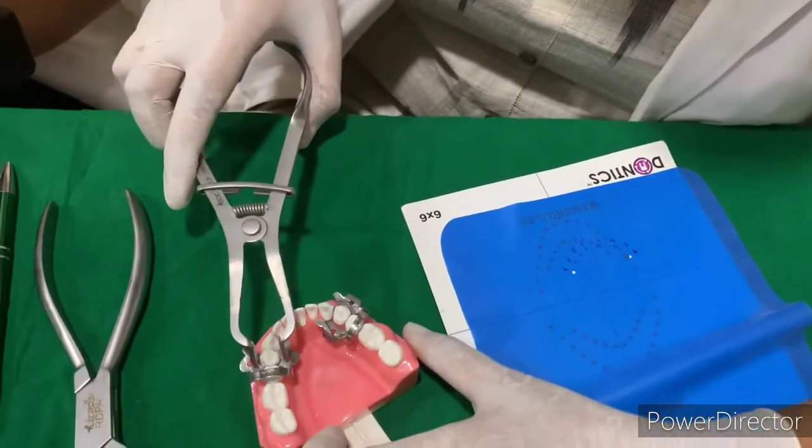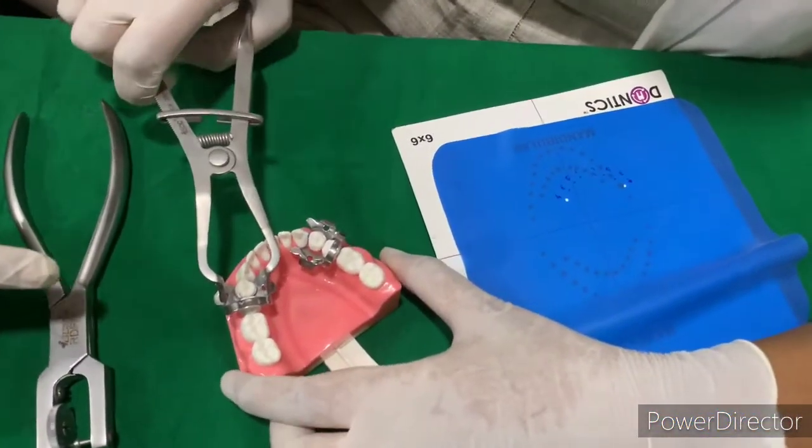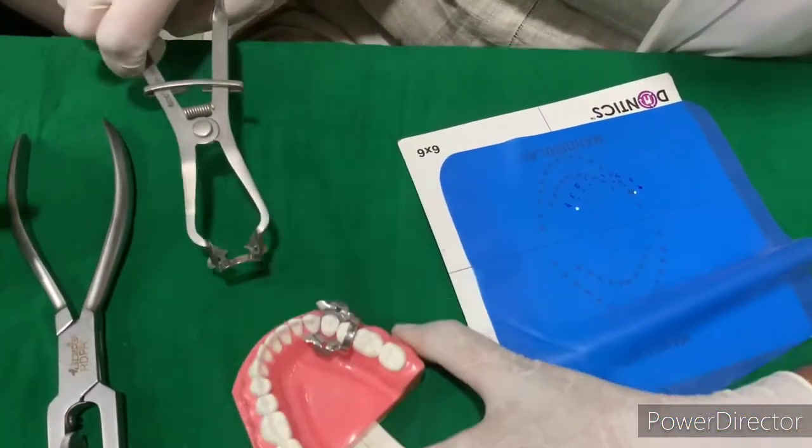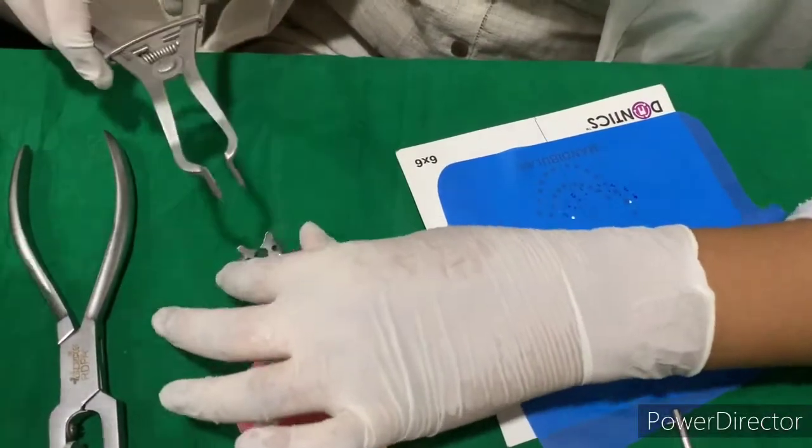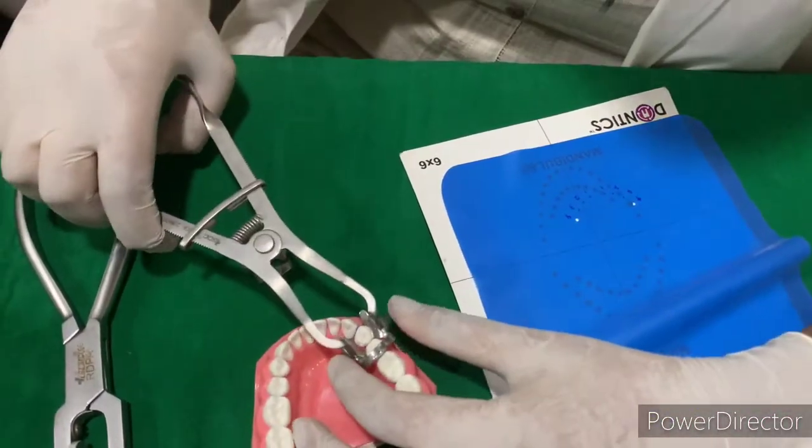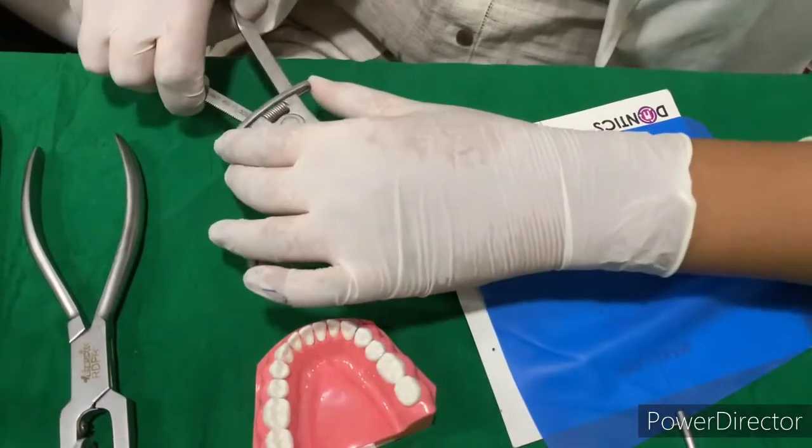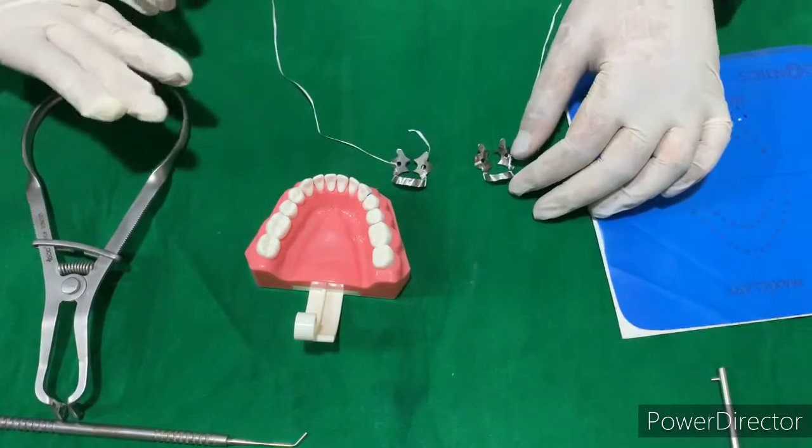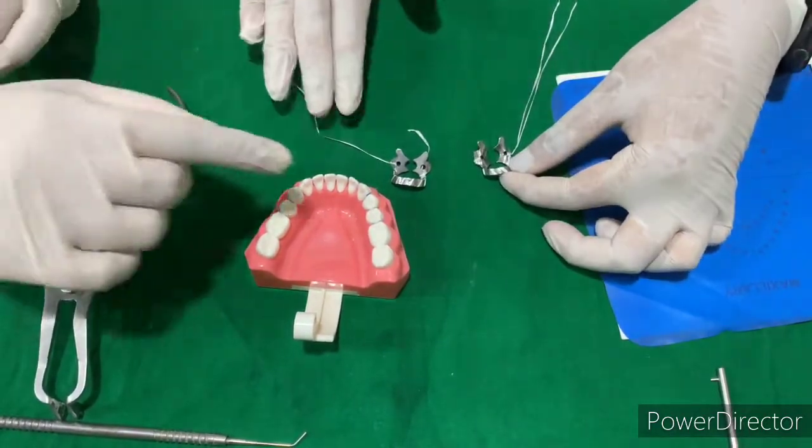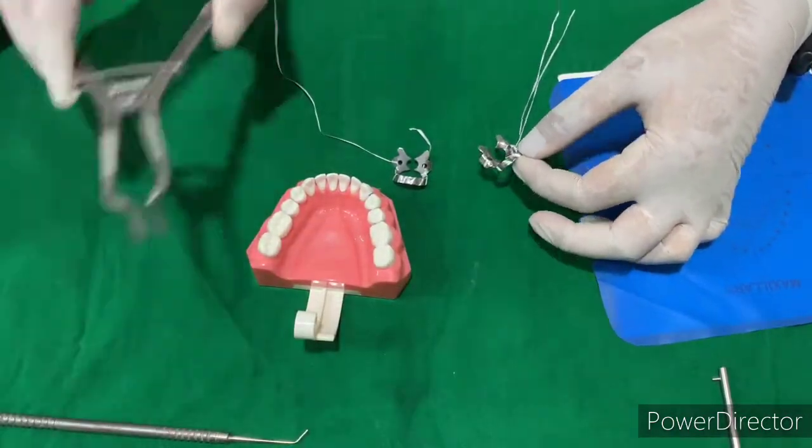Now we'll take the clamp. It's selected now. We'll floss it, then place the clamp and the dam together. Now the flossing is done for the clamps. We'll place the dam and the clamp together.